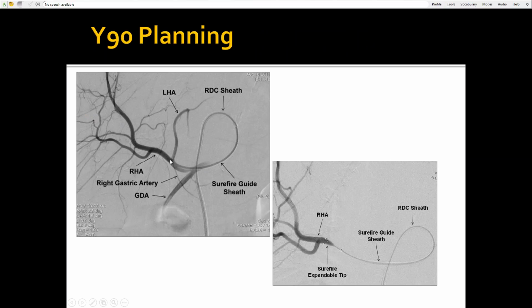Sometimes now we're being able to avoid having to go too deep, or having to embolize all these arteries. Because if, let's say, the tumor is way up here and it's being fed by this branch, then you could get by with maybe not having to embolize these, because the chances of reflux all the way from up here are pretty slim, and the likelihood of particles going places where you don't want them to is really low. So these are all things that you guys will learn about, or whoever's going into interventional radiology.